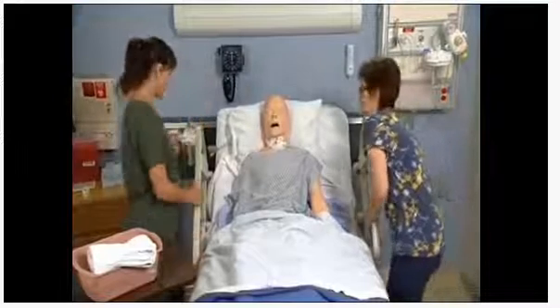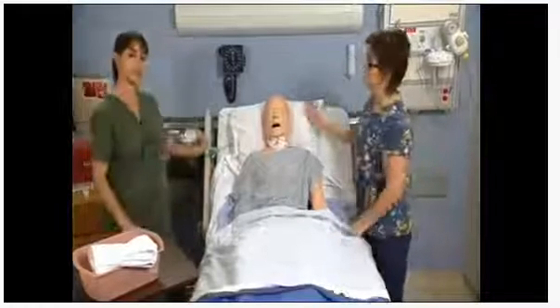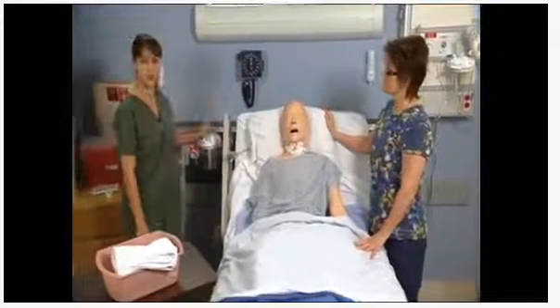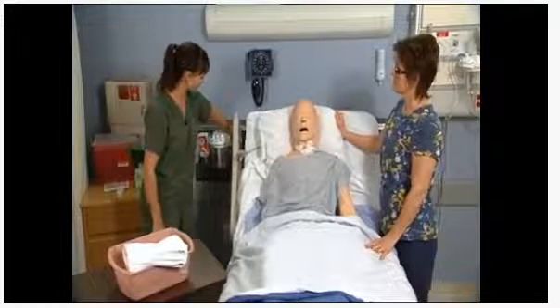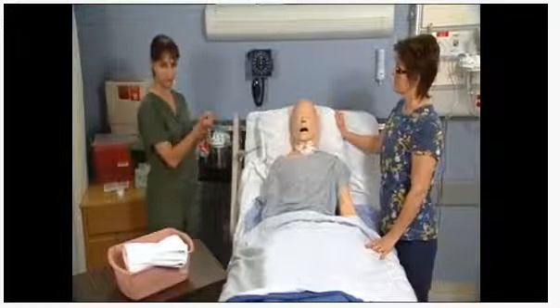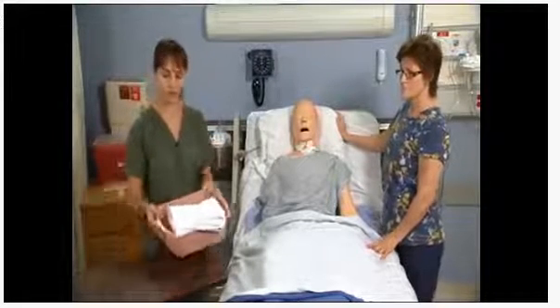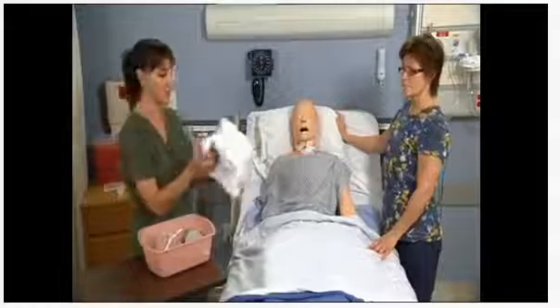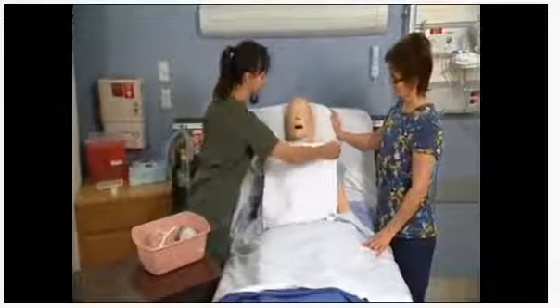Okay. What I want to go ahead and do is I'm going to put the side rails down. I need to make sure that I have a suction canister, that it's hooked up and that it is working. I would turn it on and then just make sure that it is properly working. And then I'm going to have all of my equipment here. I'm going to need a towel, which I'm going to lay over my patient. Mrs. Jones, I'm just going to lay this right here, okay?